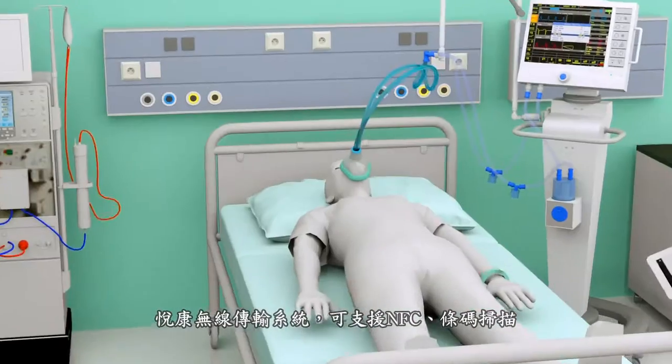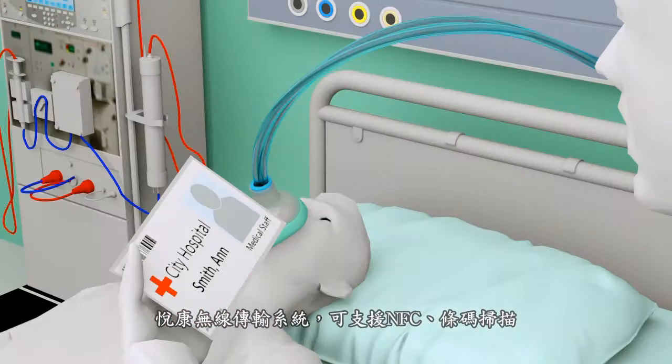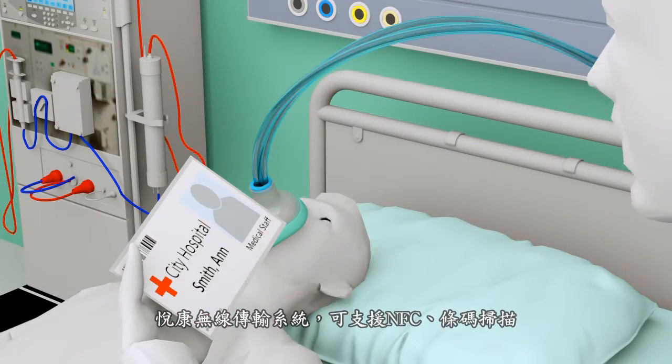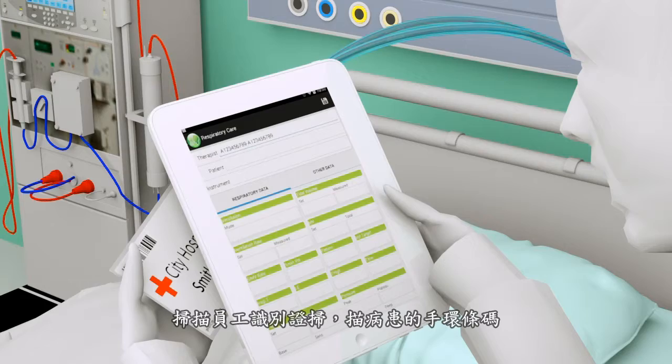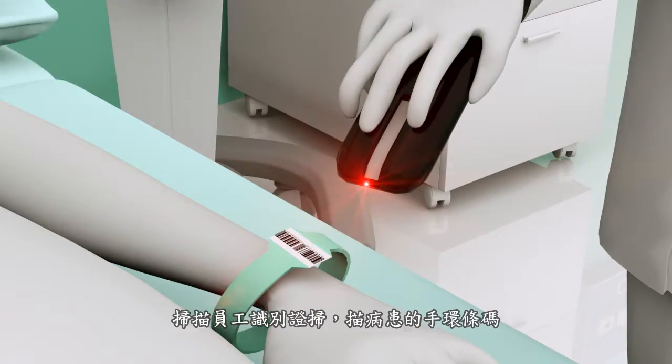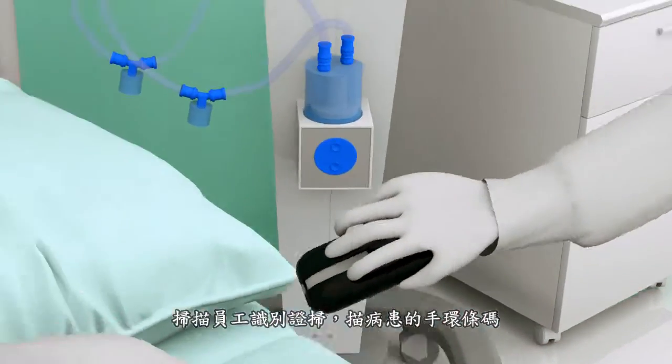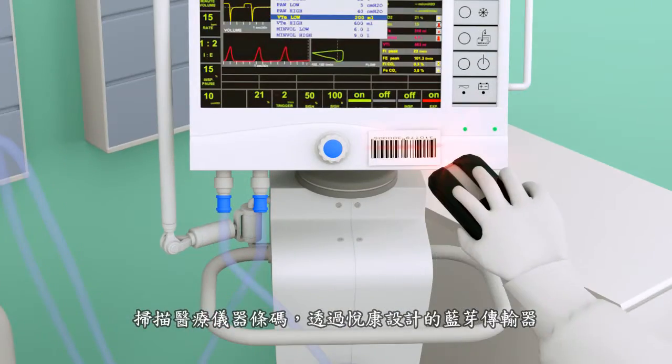Uekong YDOS solution utilizes NFC and barcode scanning method from staff, from patients, and from medical devices.